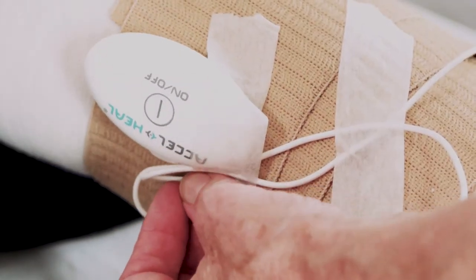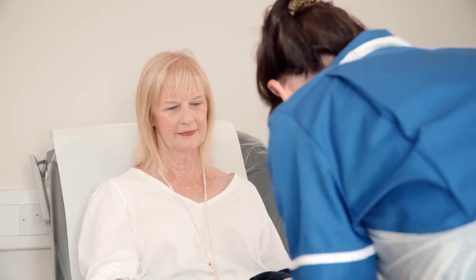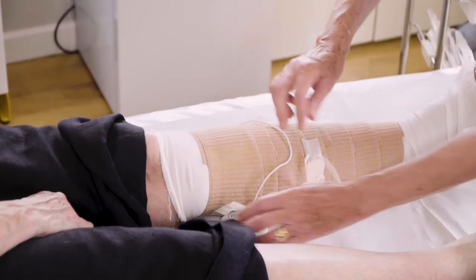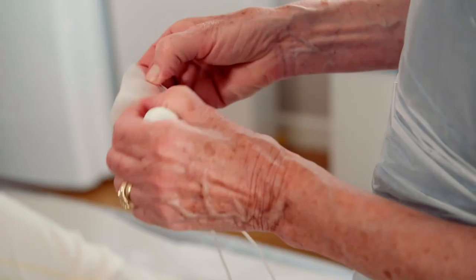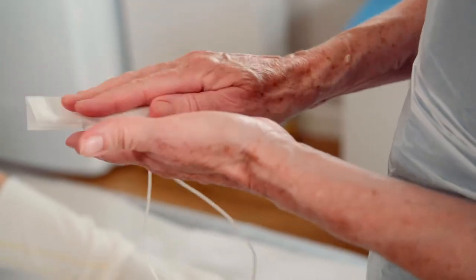Each treatment device runs for 48 hours, after which time it will switch off automatically and will need replacing with a new one, which can be easily accessed without disturbing the dressing and compression therapy. The dressing and wrap can be changed according to clinical need and local policy.